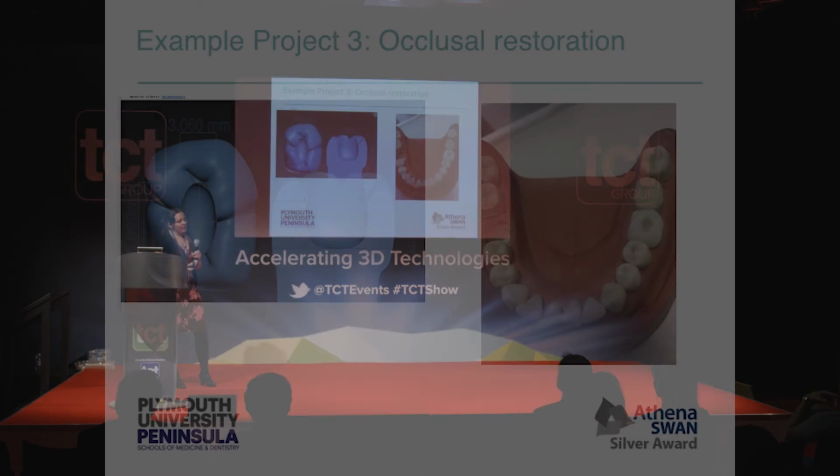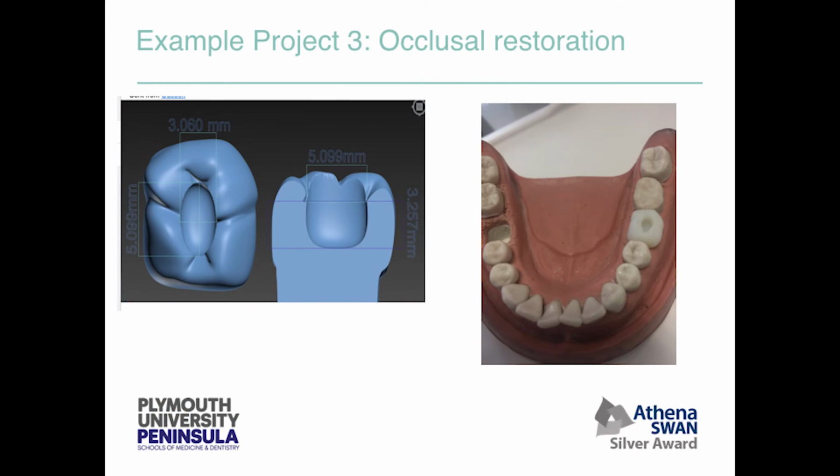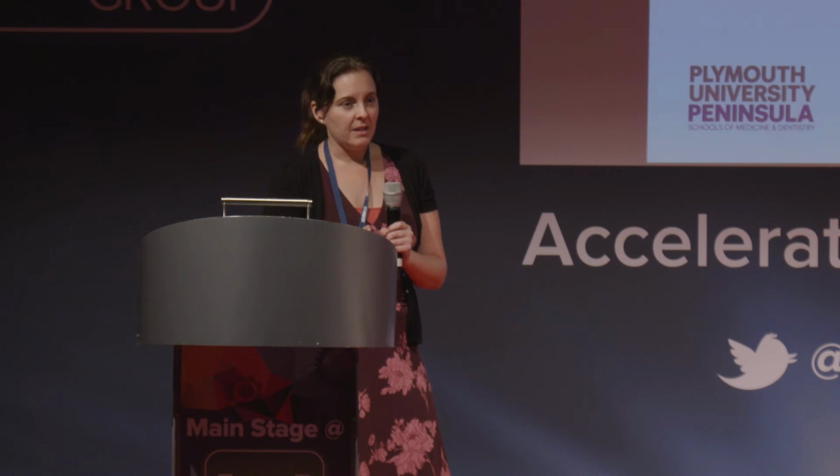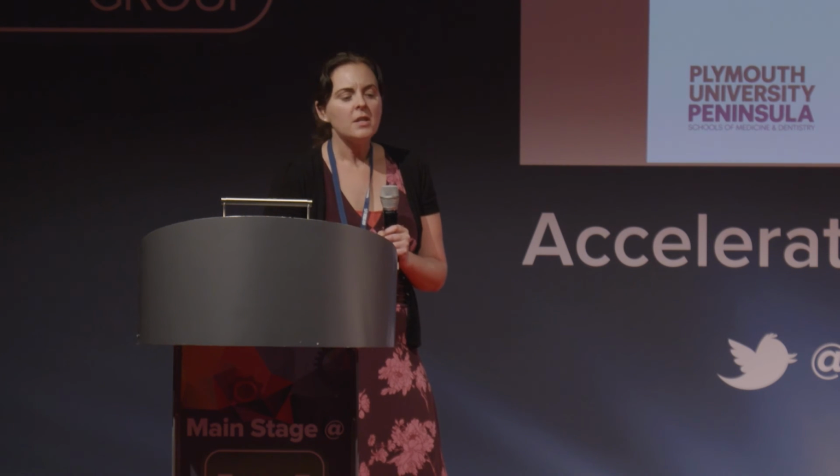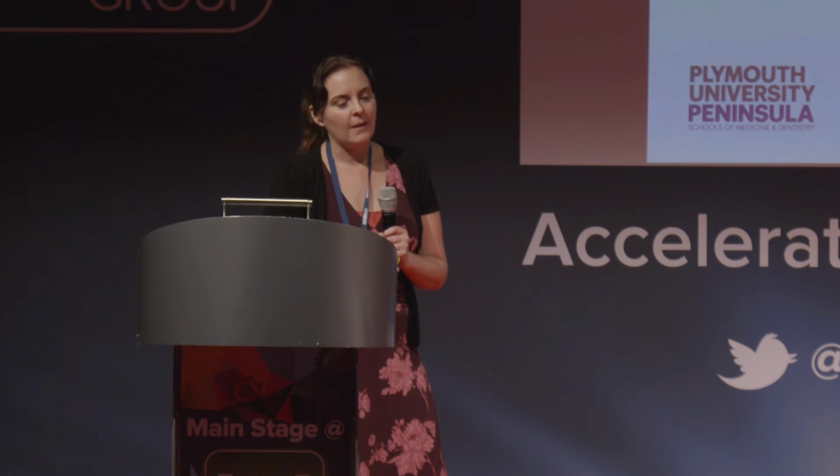And then finally, we have this model, which is an occlusal restoration. This is when they're practicing placing fillings in back teeth. And again, what we used to do with this is buy the white blank teeth, drill a hole in it, and then they would practice filling it. And again, this was really time consuming for our technicians. They'd be spending hours and hours drilling these holes for the students to just put fillings in, which would then have to be drilled out again.